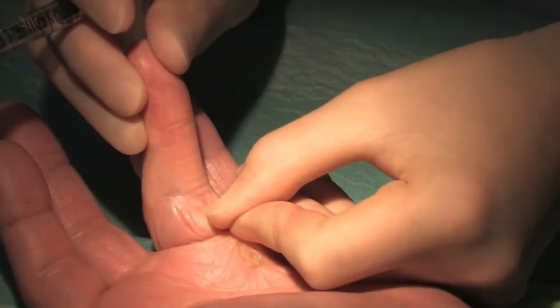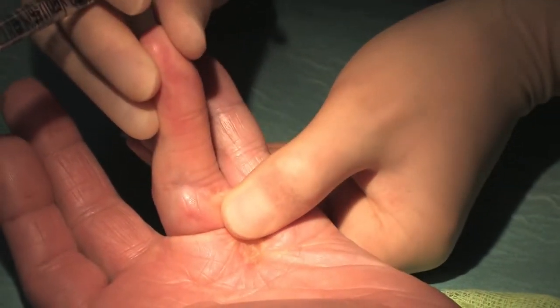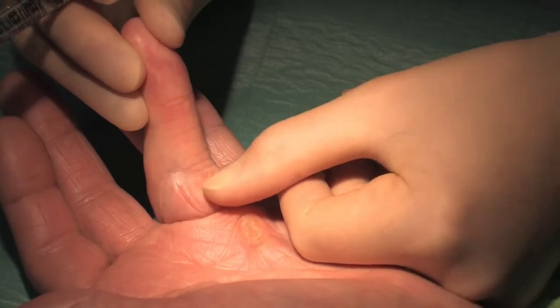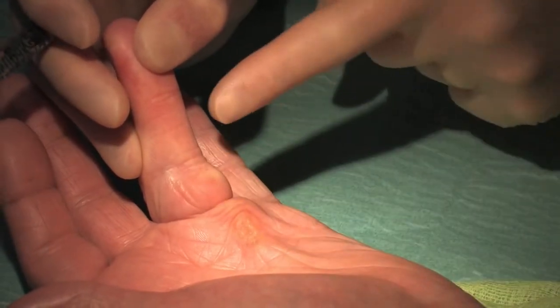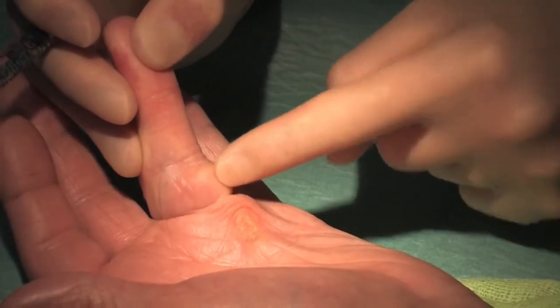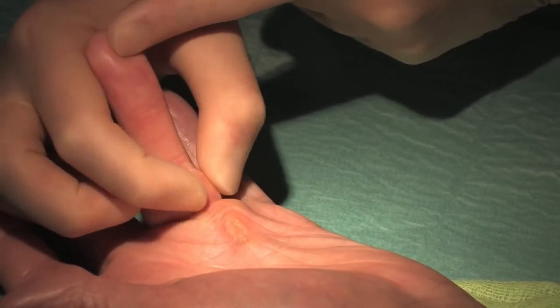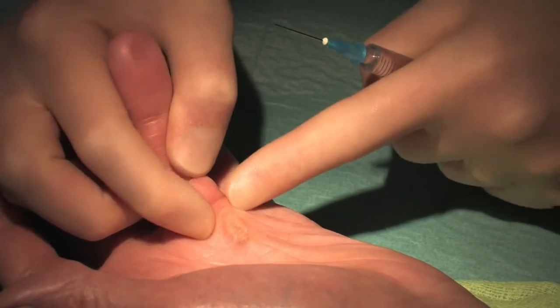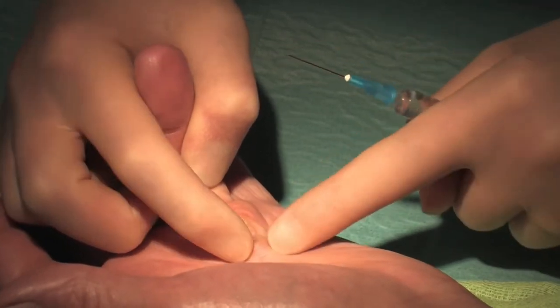There is a skin pit here, which is the point of attachment of the Dupuytren's cord to the skin. We want to go proximal to that because we don't want to go through that fold of skin, but we want to use that as the point that will allow things to straighten out. If we go distal to that the cord will still be attached to the skin and we won't be able to get extension. We can see that the skin is loose proximally, but firmly attached at the crease.